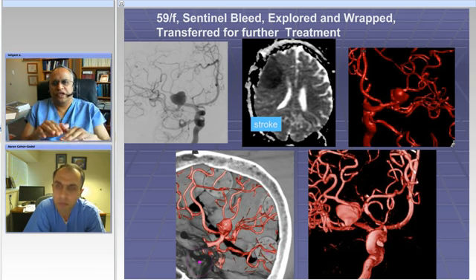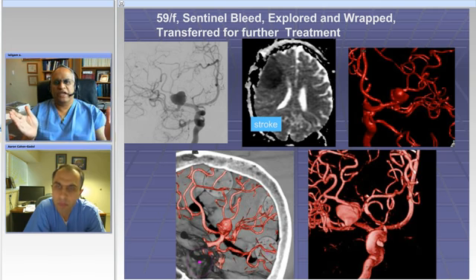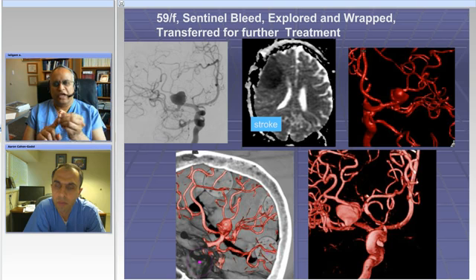He was always using it on top of patties, cotton patties for retraction, so the patties don't stick to the brain. We just take a glove, and of course nowadays you have latex-free gloves, and you can cut it in various shapes. For aneurysm surgery or for using it as a background, we just cut a very thin piece, usually half a millimeter by, let's say, half a centimeter by 1 centimeter in length.